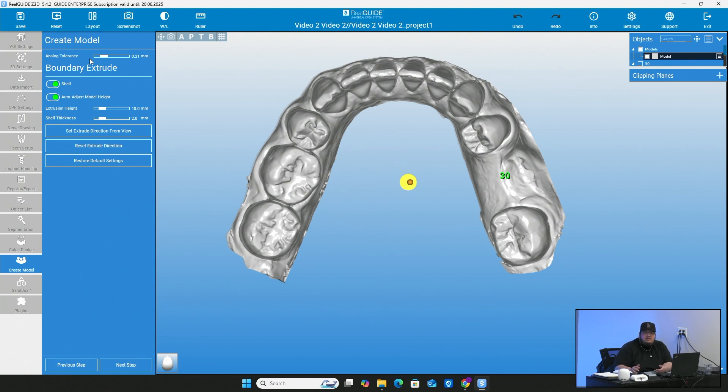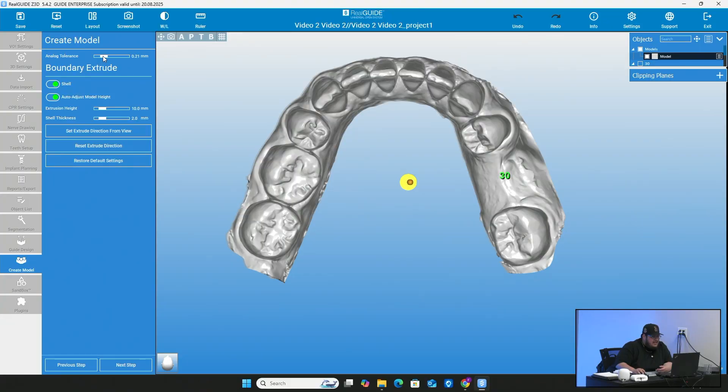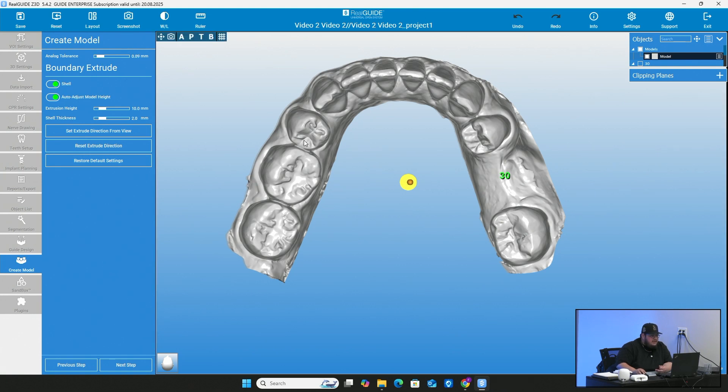You should want the analog to kind of drop right in. But of course you don't want it to move around or have too much clearance to kind of change the angle or anything like that. So anywhere from 0.05 to 0.10 is going to be your kind of sweet spot that you want to stay at.